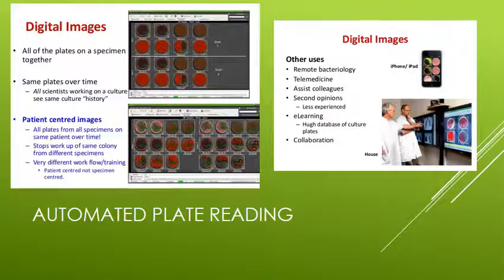And then we have also coming up the pike, automated plate reading. Now this makes someone like me, who grew up manually and really likes to see the plates, a little nervous, but I can see the benefits of it, okay? Basically, what you have here is something that the microlab never had. We never had evidence of what we actually saw.